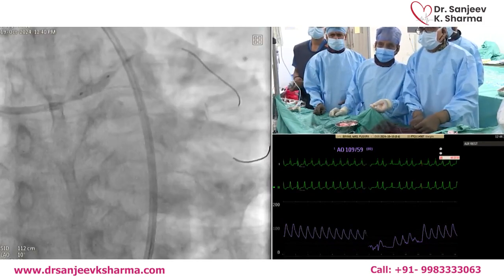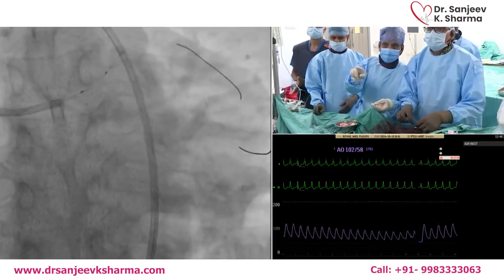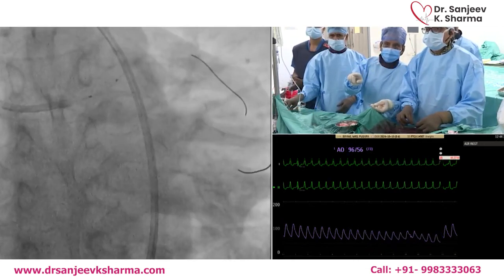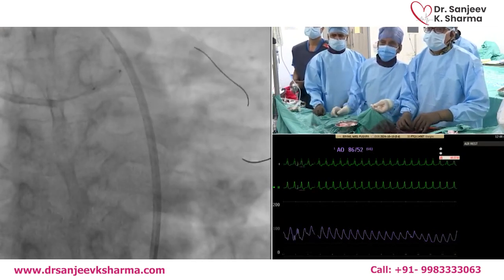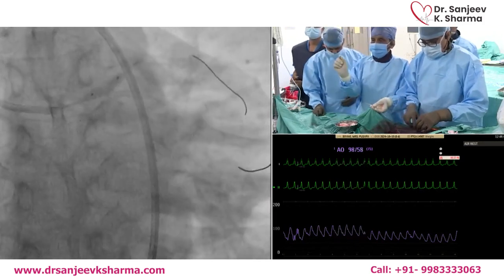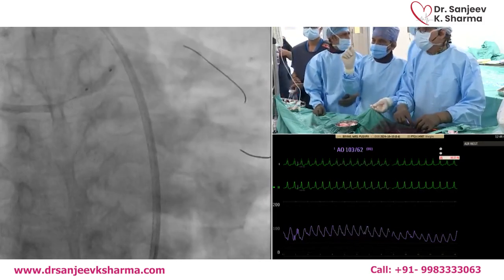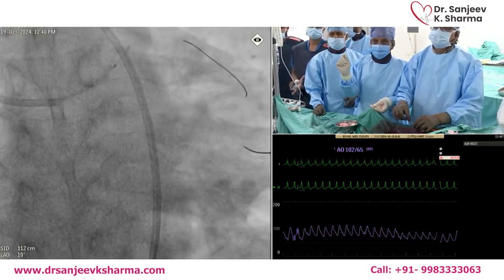Yeah, I think it's just basically what you believe more. Eccentric. Yeah, so go negative. We have to go a few millimeters inside for the cutting. Yeah, go up. So just coming back to a very good point, I think in this case, remember, it's not only the circle. It's the thickness. Many things will depend on thickness and the length.